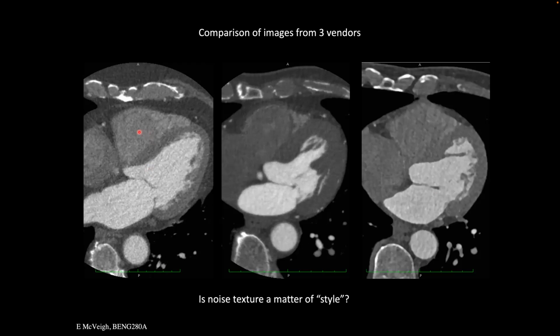And I'm assuming you say it looks like it has the best definition in that you probably believe the definition, right? Because it looks like the noise is out here. It's kind of the most honest image of the 3. And you can appreciate in this image what the noise is, like how much actual noise is there, as opposed to smoothing it out.